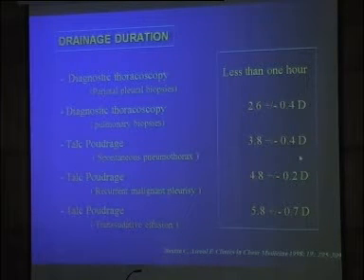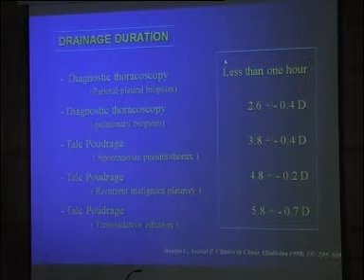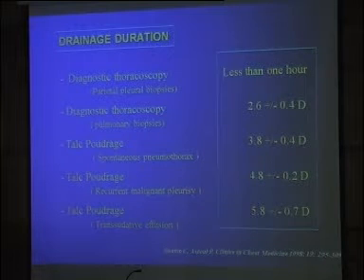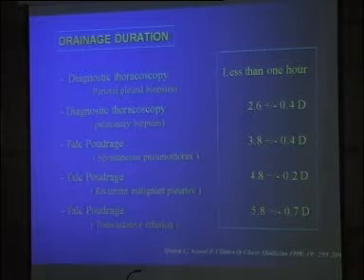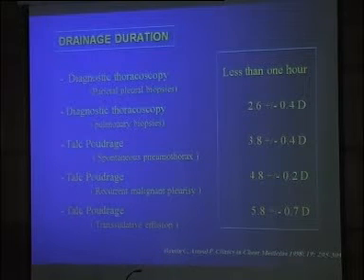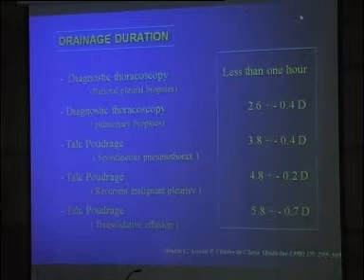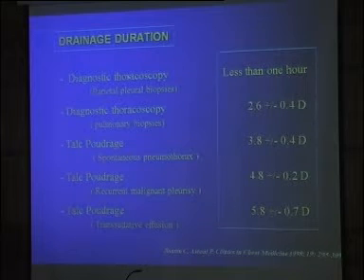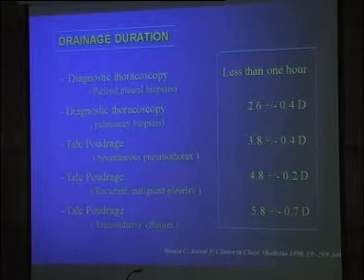Then to summarize the drainage duration, in case of diagnostic thoracoscopy, usually it's less than 1 hour for us. We remove the chest tube on the table or in the recovery room in patients under general anesthesia. The message for our nurses is very important. It is not more work, not management of the chest tube in the ward, which is very good, because it's time consuming to take care of chest tube aspiration, etc. And in case of diagnostic thoracoscopy, you do not need a prolonged drainage of the pleural cavity.